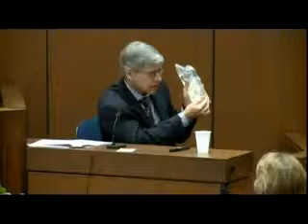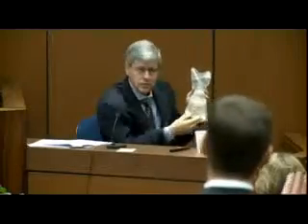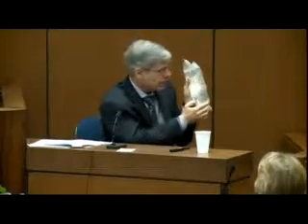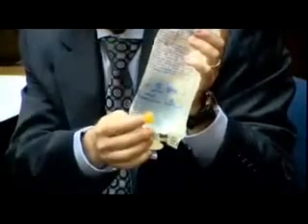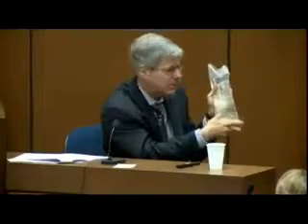This port right here, this is a kind of rubber that you can stick a needle into. I'm referring to this one here, I'm sorry. This orangish port here. You can stick a needle into that and either draw saline out into a syringe, or for some reason you might want to inject another drug and mix it into this bag. So that's a way of accessing it. It's a special kind of rubber so that when the needle is removed, it self-seals, and you don't have a little constant leak coming out of that.